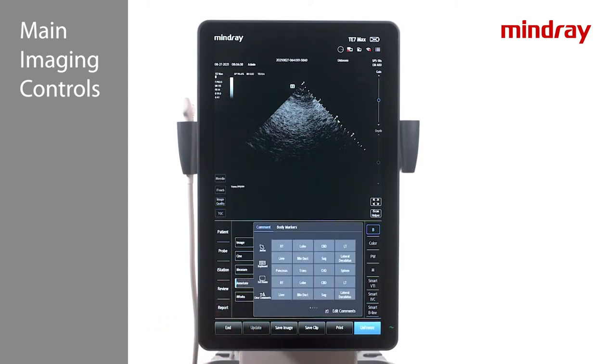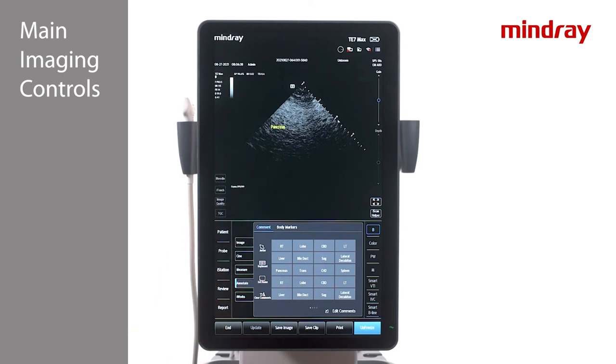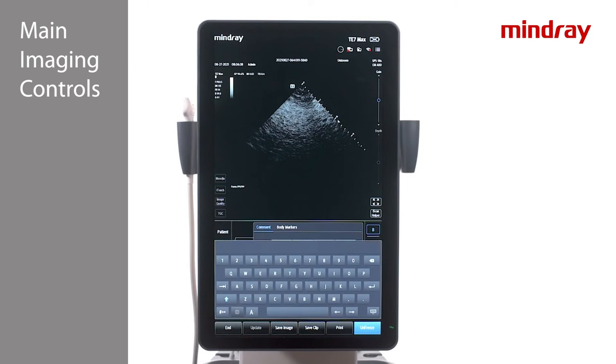To annotate on the image, press the annotate key located on the bottom of the touch screen. There is the option of using the preset annotations or manual entry. Tap on a word to highlight it. Press delete word to delete one word at a time. To move annotations, press and hold on the words and drag a finger to a desired location on the screen. Tap the keywords again so that they change from yellow to green. To delete all text, either press the delete key or press clear comments. To freehand type, press the keyboard key under the annotation tab.